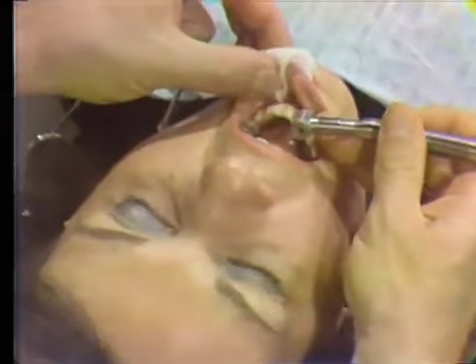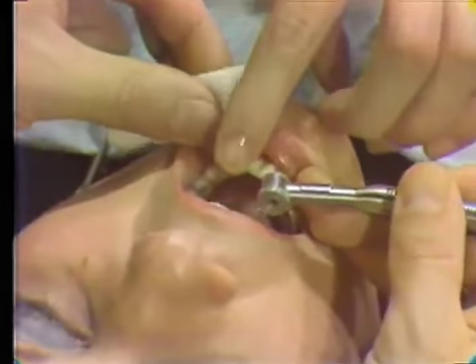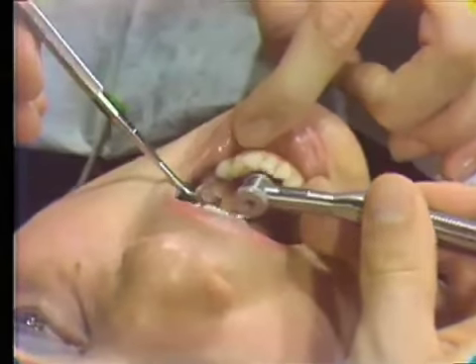Access and visibility can be improved by readjusting the patient's head position as needed during the various phases of preparation. Generally, slight chin elevation with the patient's head turned toward the operator is most helpful. If direct vision is used, then the operator can retract the lower lip using a 2x2 gauze sponge between the thumb and index finger of the left hand. The dental assistant can retract the lower lip with her left index finger when indirect vision is used.